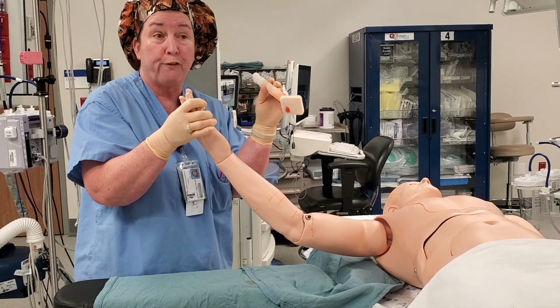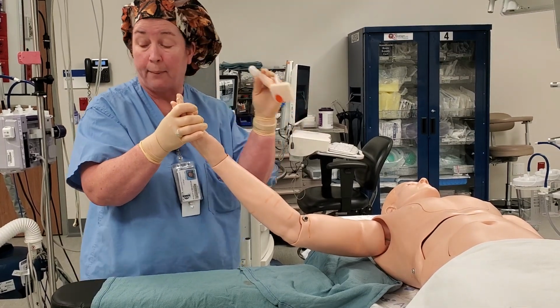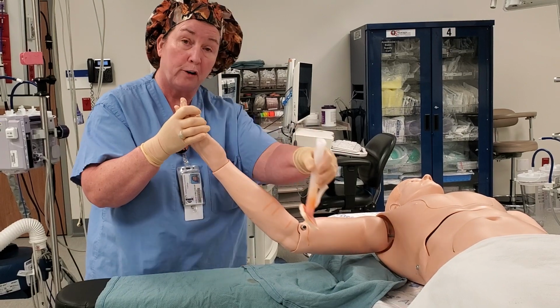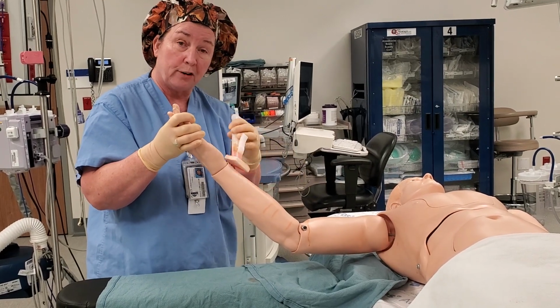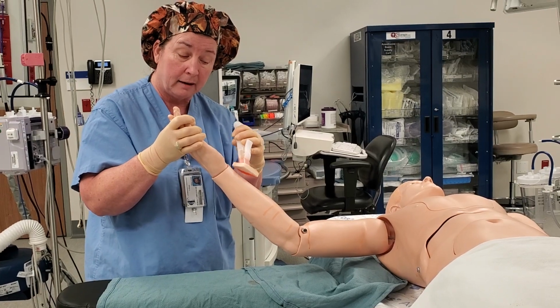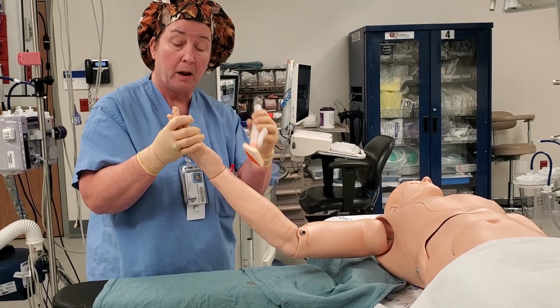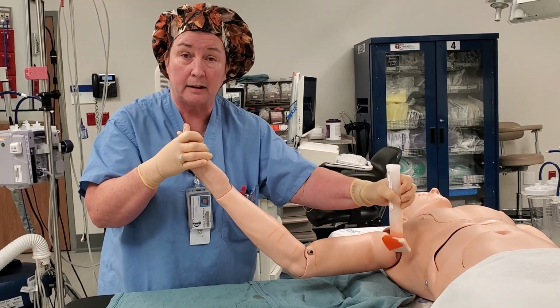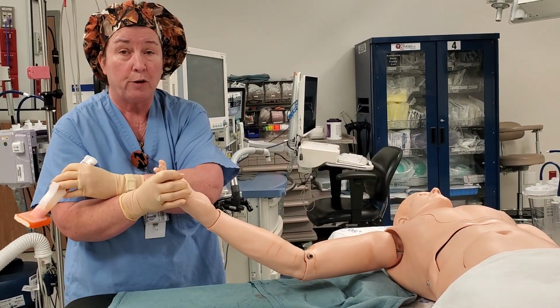I would prefer to get a new one. So at this point, I probably would get a new one, come down from the ulnar nerve prep, do my 30 seconds over my carpal tunnel site, catch my arm, now do the hand and the back of the hand, and then do my axillary area last and throw this one away.